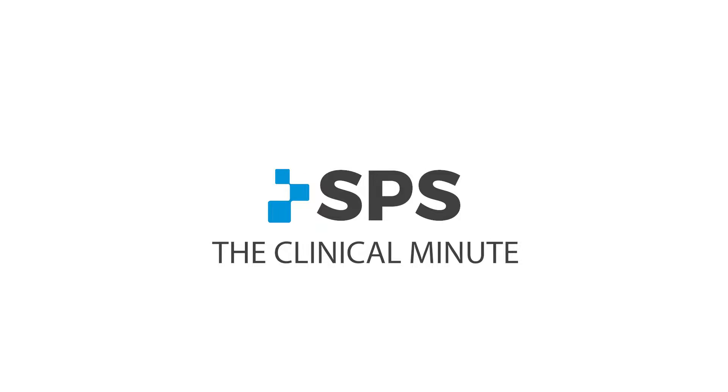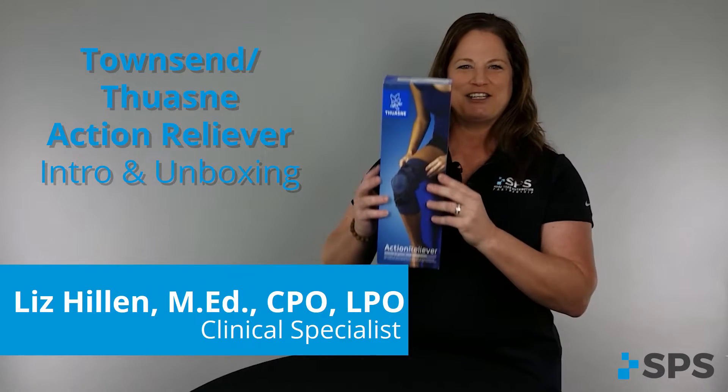Hi, I'm Liz with SPS. Welcome to the Clinical Minute. In this segment, I will discuss with you the Townsend-Thuasne Action Reliever.